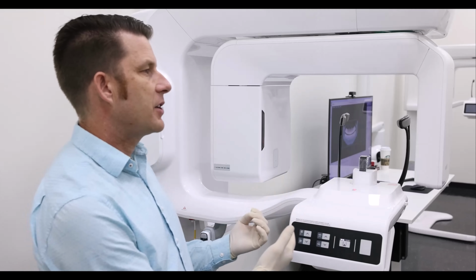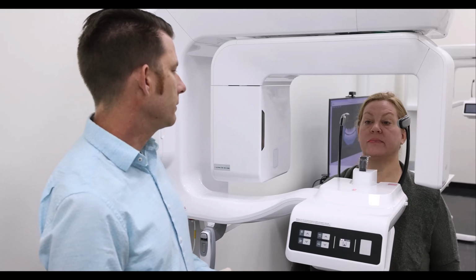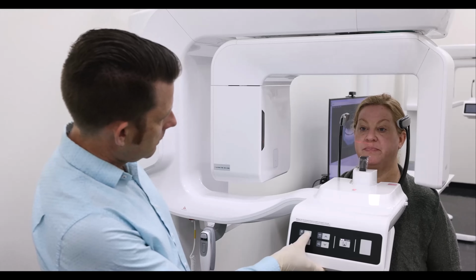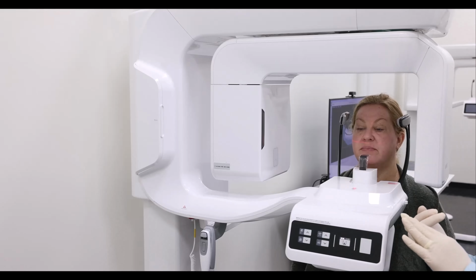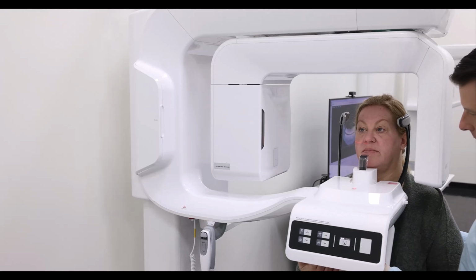First, I'm going to go ahead and bring my patient into the machine. Go ahead and stand up straight for me. And again, I'm going to get the chin rest just below her chin by moving the column up and down. And then I'm going to walk over here and we're going to do the same thing. We're going to start with our hands, our feet, and then bite on the bite stick. So go ahead and bring your hands up and palms facing up, feet shoulder length apart.